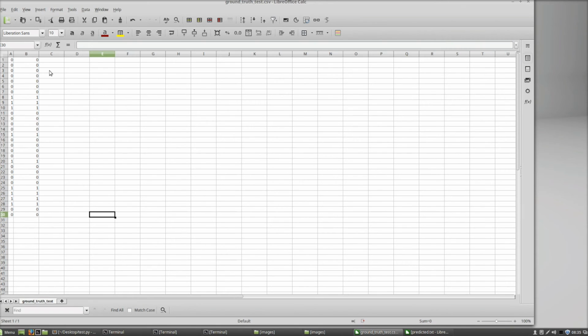We also plan to export our software to smartphones, to iClouds, anywhere where you can write a wrapper, to be honest, because we believe that this software can be utilized by many people, and especially people with smartphones and stuff.